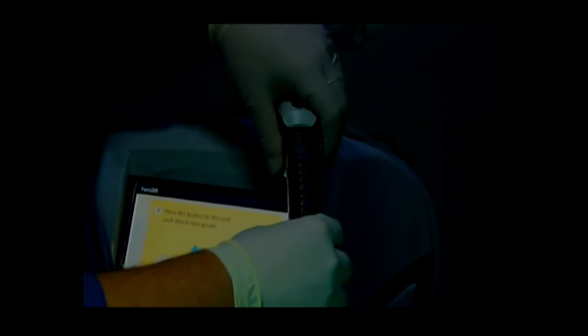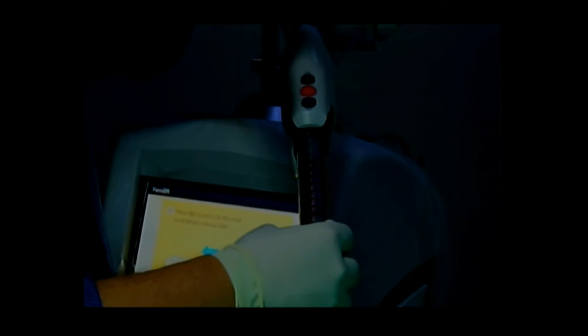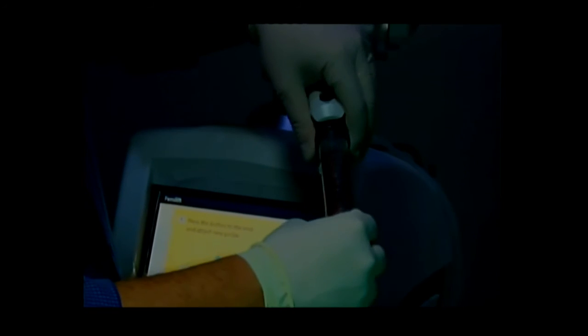Okay, so again, we mount. So you examine the vagina, and is there any cystocele associated with SUI, or it is just very minimal? Very minimal cystocele. She's the perfect candidate. Minimal grade 1 minus cystocele and pure stress incontinence. She's an excellent candidate for that kind of a procedure.